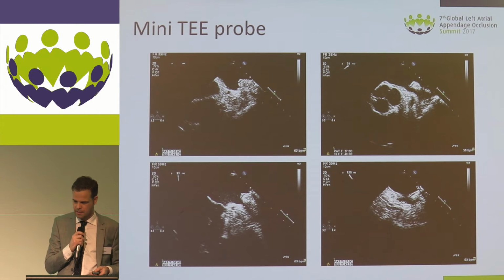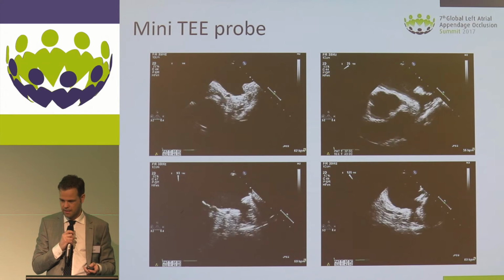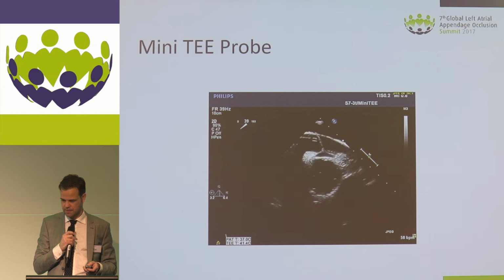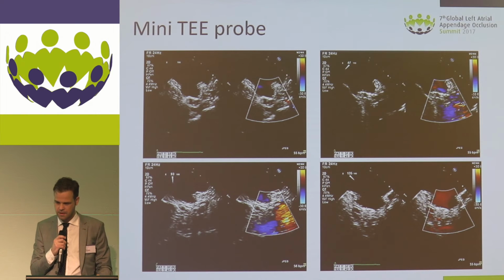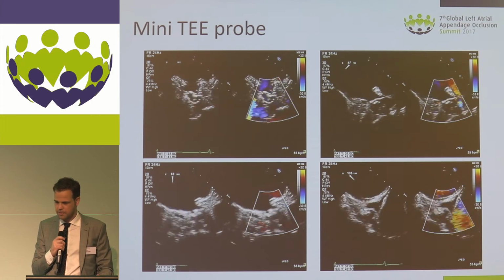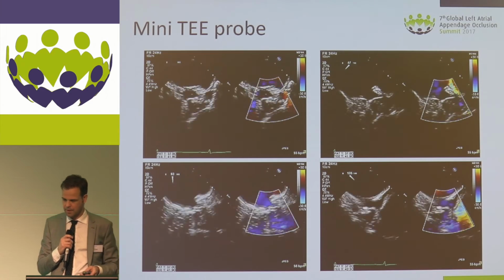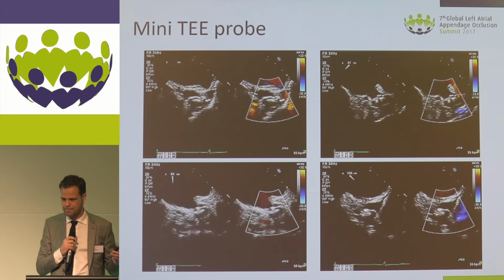Moving to a procedure we did Wednesday, hopefully they run, yeah, the different views before the procedure again, nicely showing and easy to recognize the structures and do the measurements on this. And then after sheath placement, completely in the LAA, we move on to the measurements and placement of the device, and this is post-implantation with color Doppler, turning the baseline really down to 30 centimeters a second to find these small leaks that can be harder to detect, and very nicely seen that this is a perfect placement, in this case a Watchman device, with an excellent closure of the LAA.